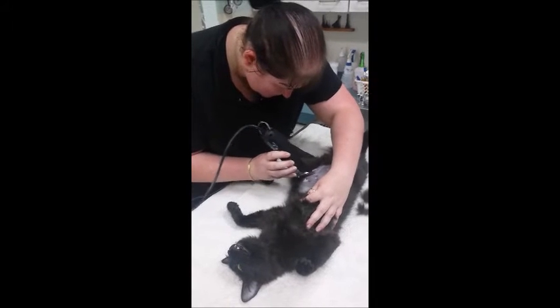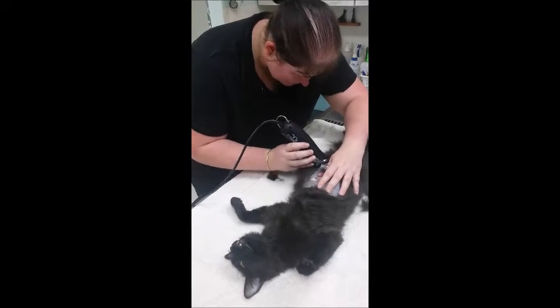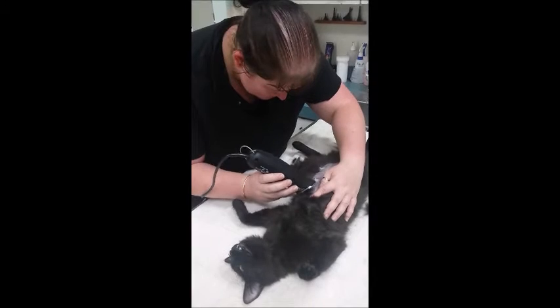When clipping for surgery, always clip larger than the expected surgical site, just in case the incision needs to be made bigger, and to stop unwanted hair from contaminating the sterile surgical site.